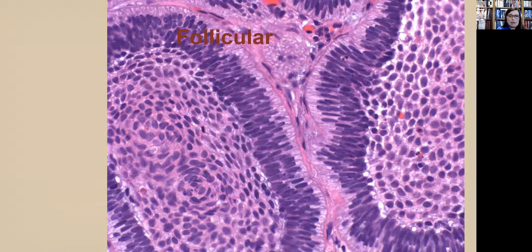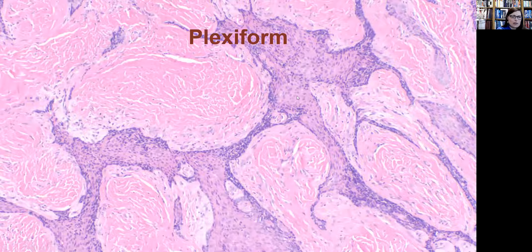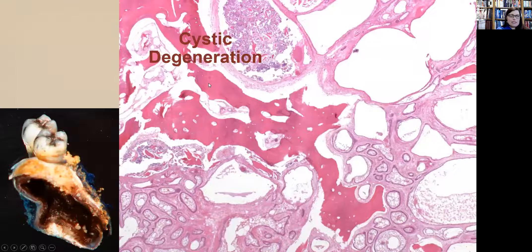The follicular pattern is the most common we see in the mandible. We see this large nest and at the basal cell layer we see what we call reverse polarity, where these columnar cells have nuclei polarized away from the basement membrane. The other pattern is plexiform, more commonly seen in the maxilla, featuring a dense fibrous stroma with interconnecting bands of epithelium. Within the follicles themselves, the stellate reticulum is undergoing cystic degeneration.